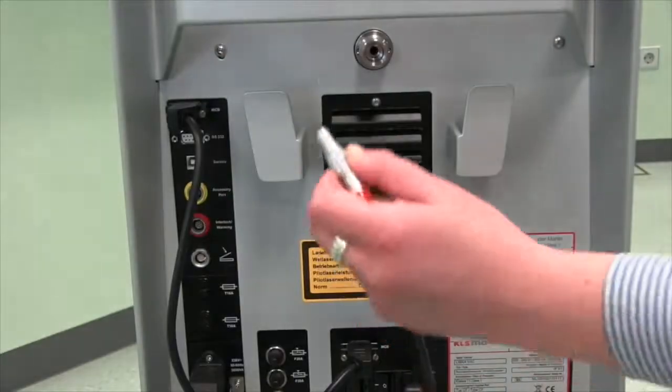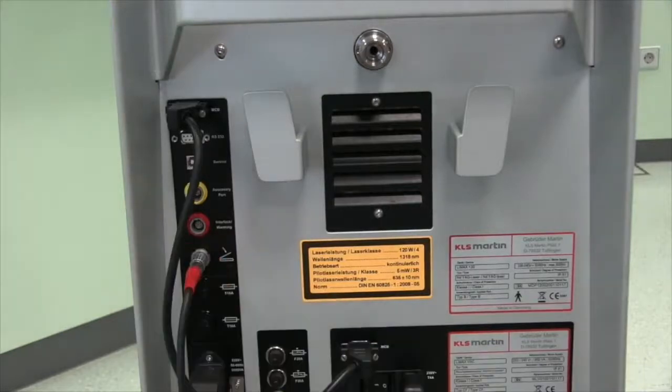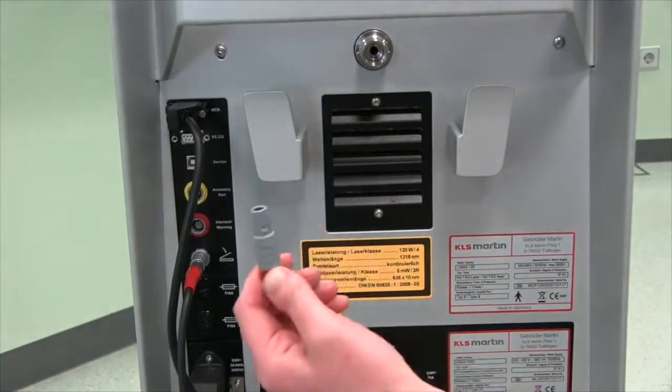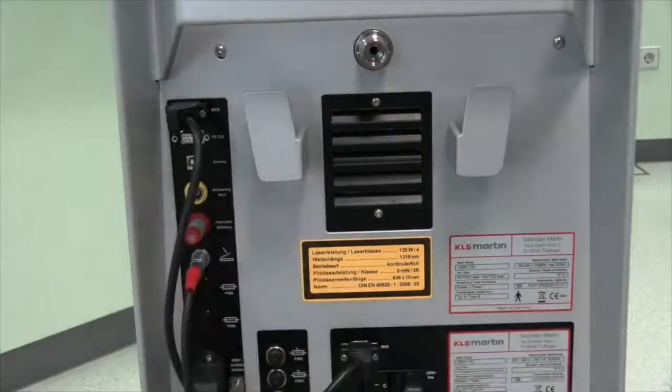In the next step, please plug in the foot switch. If you are not using a door interlock or a warning lamp contact, the interlock socket needs to be bypassed with an interlock plug included in the delivery.